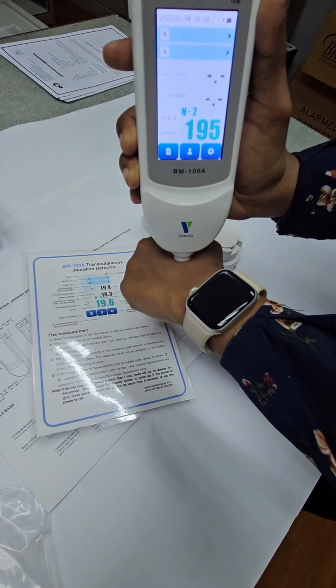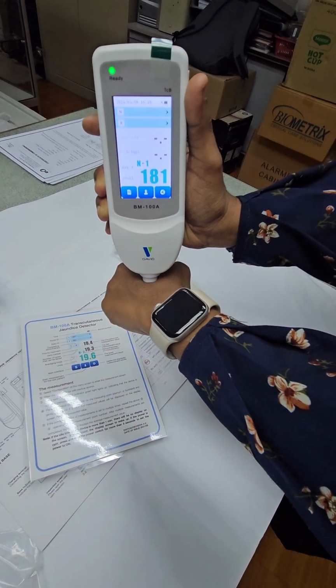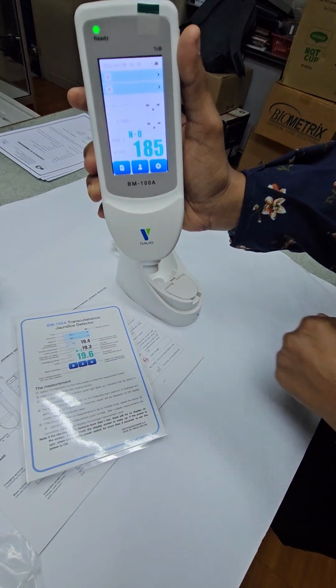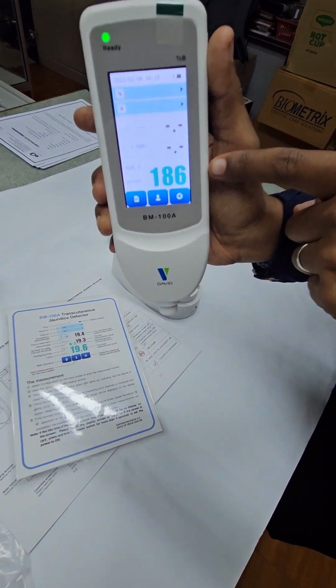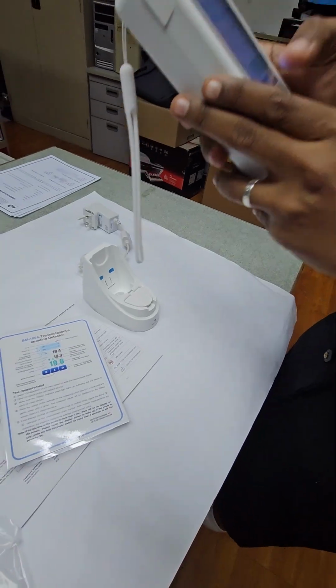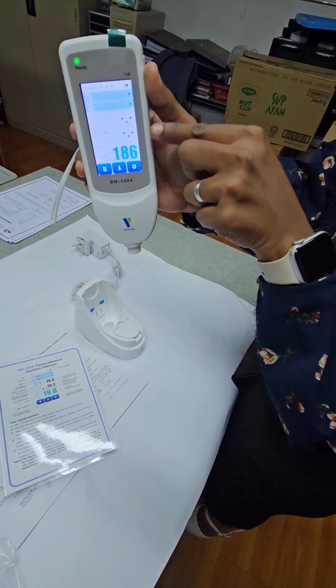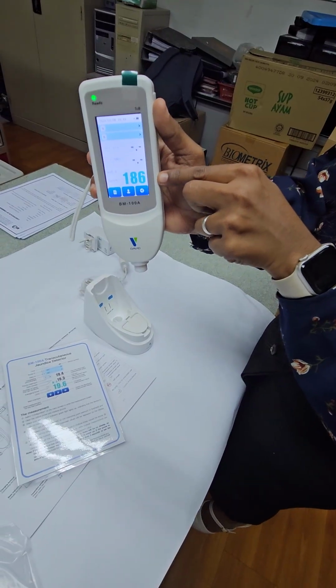Let's say 1, 2, and 3. So this is my average. The memory will store the average number. So if there's another new patient, then my result will go up, and the new patient's result will be at the bottom.